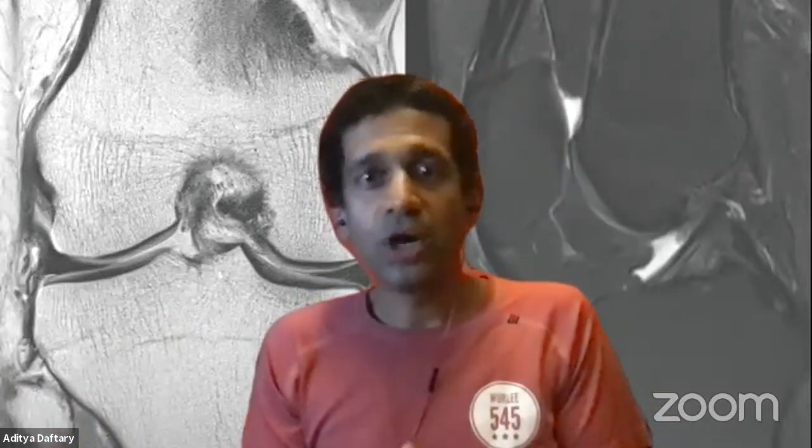Perfect. As opposed to if you just saw somebody scanned at 6 weeks, then you would not have a sense of what happened earlier on in that imaging. And the key thing, where it comes to you guys, is somebody may come to see you 6 weeks after an injury. You get a fresh MRI, you look at it and you say, oh, everything looks this way. And then when you ask them, did you get an earlier MRI? And they say yes. And you look at that earlier MRI, you will find all those things in that. Absolutely. And then you say, okay, now it makes sense. Thank you. Yeah, Bhupesh, you had a question.